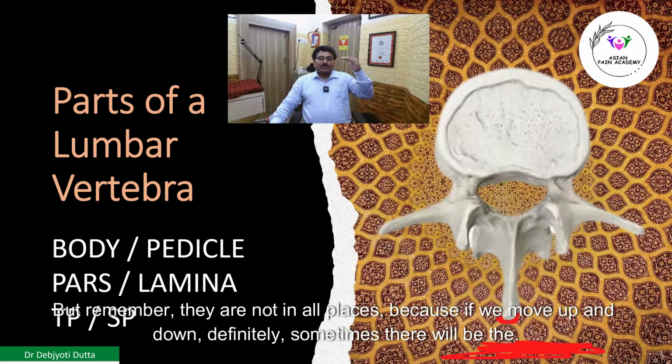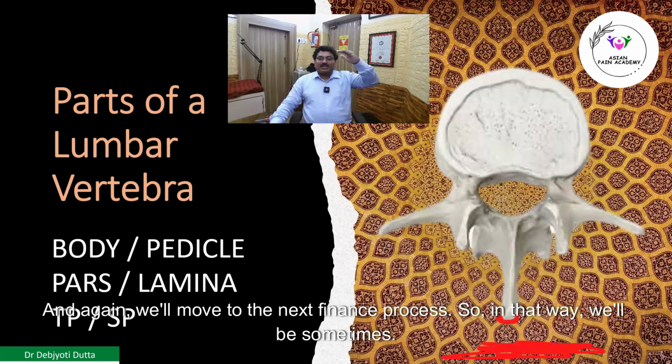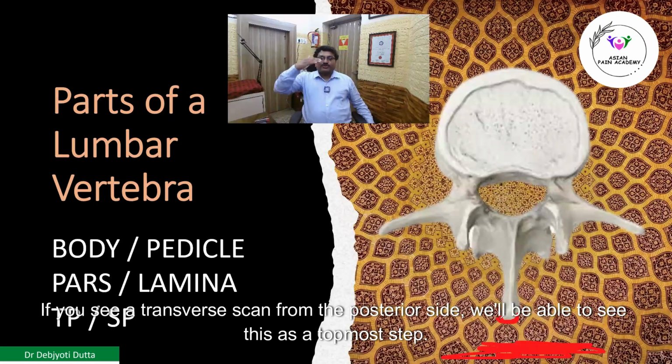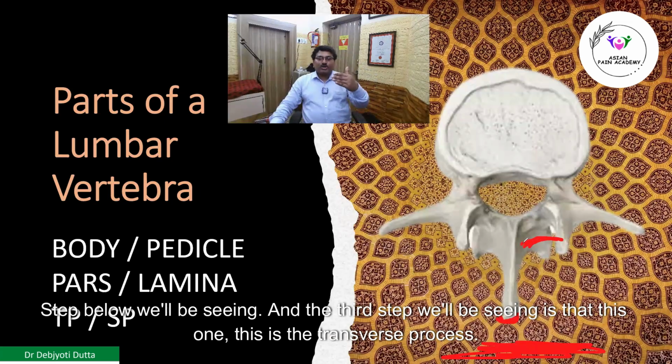But remember, it is not in all places, because if we move up and down, sometimes the spinous process will be present, and it will go to the interspinous area, where there won't be any spinous process. And again, we'll move to the next spinous process. So in a transverse scan from the posterior side, we'll be able to see this as the topmost step. And the next step will become this one. That means this is which structure? The next step below we'll be seeing is the lamina. And the third step we'll be seeing is this one. This is the transverse process.